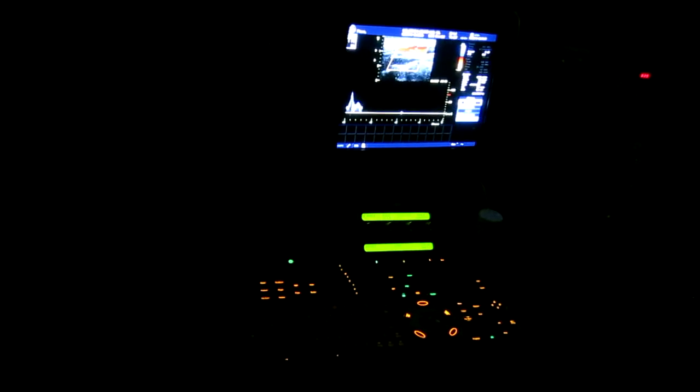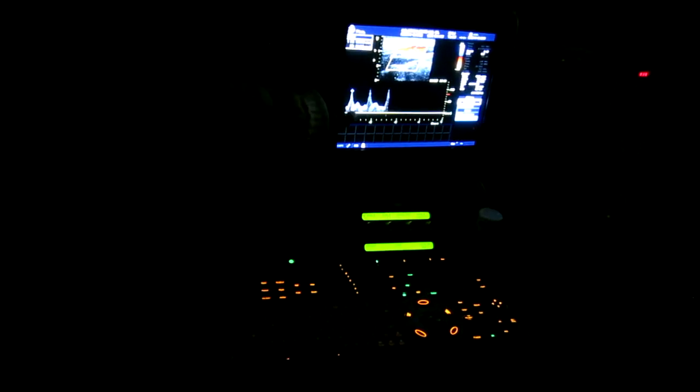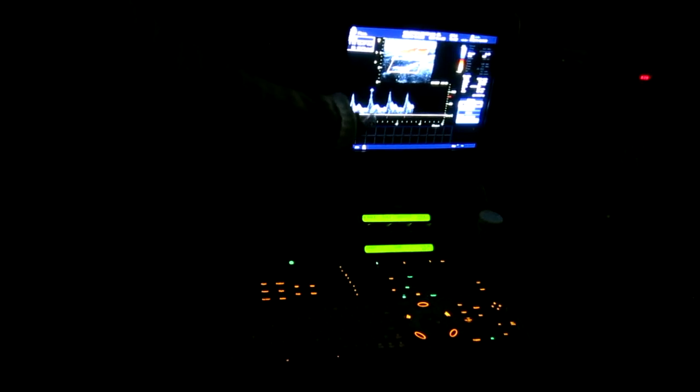You see that? Okay. And our little dash is right there, so it's going to sample blood flow right there. Does that make sense? I'm going to hit pulsed wave. Look at that.